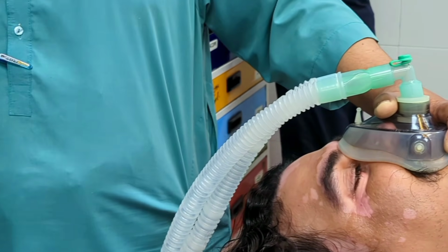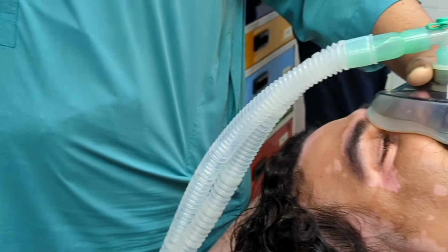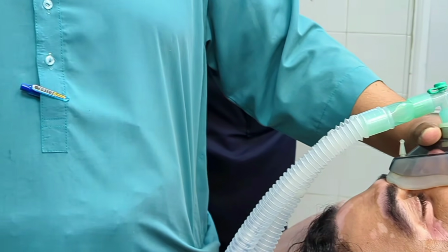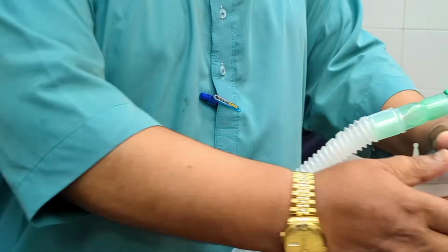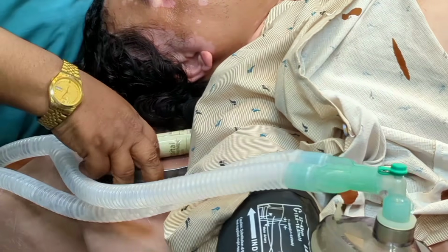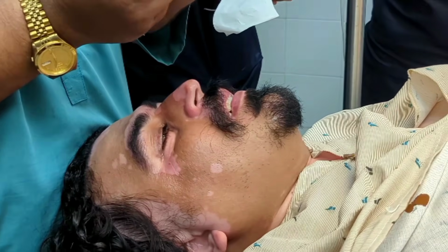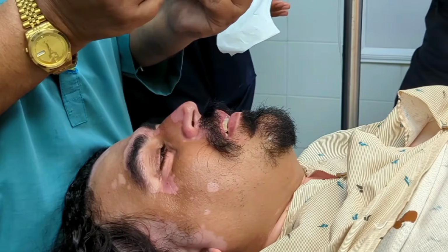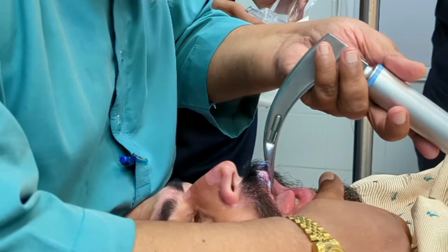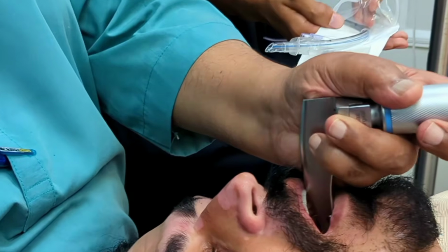During this time, we closely observed the pulse oximeter to confirm that oxygen saturation was maintained within the safe range, generally close to 100%. Once adequate pre-oxygenation was achieved, we proceeded with laryngoscopy. The laryngoscope is a specialized instrument with a handle and a blade that have a light source. It allows us to visualize the patient's airway directly and identify the vocal cords. The patient's head was positioned in the sniffing position, which aligns the oral, pharyngeal, and laryngeal axes for easier visualization.